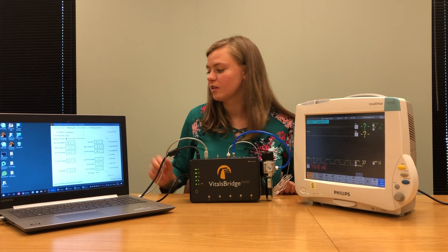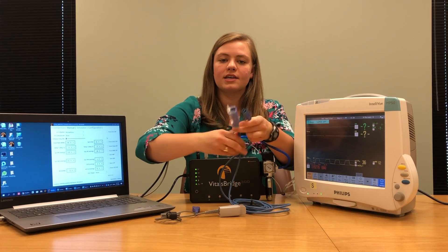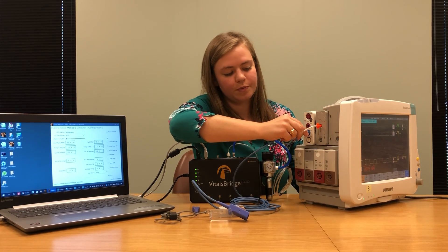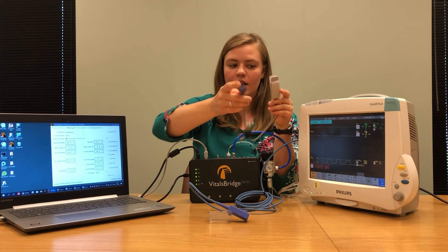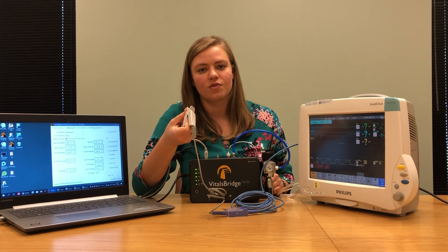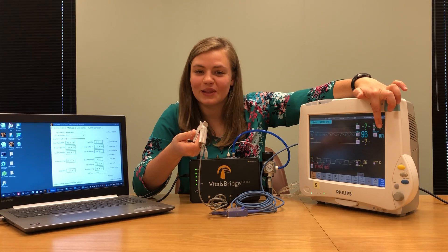The next thing we're going to connect is SpO2. Your patient monitor comes with two separate SpO2 cables. The first cable has one end that plugs into the patient monitor and one end with a seven or nine pin hole plug. Insert it on the side of your patient monitor where it says SpO2. Then take the second cable, which has a seven or nine pin plug on one end and a finger probe on the other, and insert it into the cable already connected to your patient monitor. Put the finger probe on your finger to make sure it's working correctly. You should see an SpO2 waveform, an SpO2 saturation number, and a heart rate.